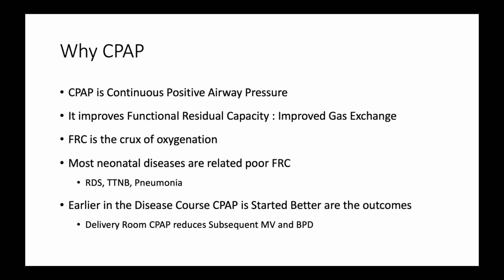So CPAP, we all know, is continuous positive airway pressure. Why is it important? Because it improves something called functional residual capacity. That is the overall lung available for gas exchange during the breath cycle. And we all know that FRC, or the gas exchange, is the crux of oxygenation. And most of the neonatal diseases, except for something like severe asphyxia where the brain is not working, but for all the respiratory causes, the cause is an FRC problem. So most neonatal problems are related to FRC, whether it is RDS, TTN, pneumonia, and many other respiratory distress.